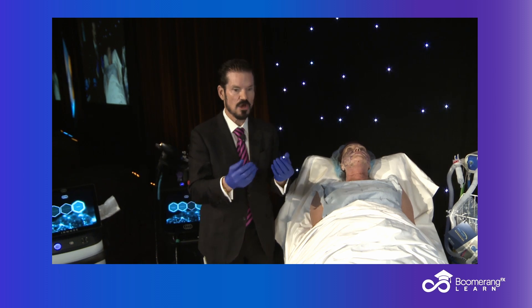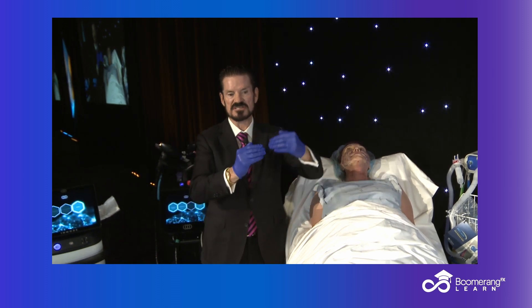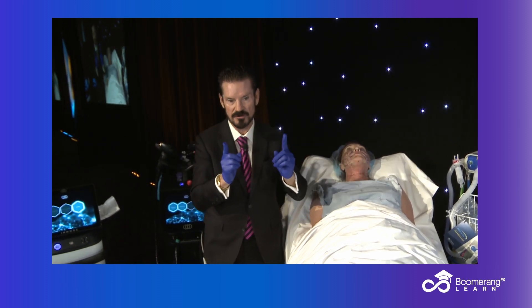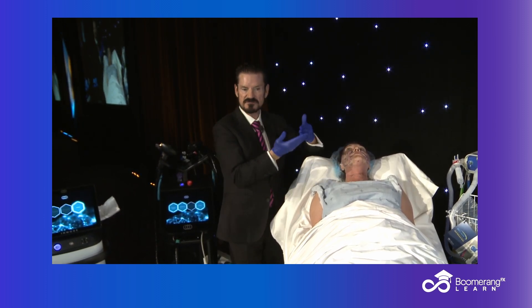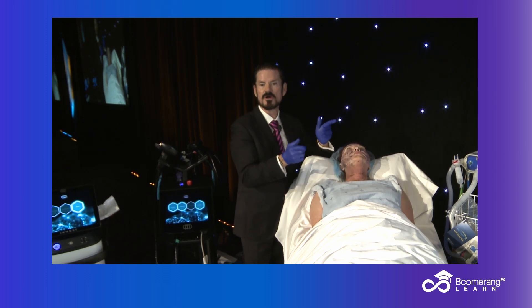The type of coagulation and tightening will be far greater than Morpheus, which takes a longer time to do. However, you have to be brave enough to put in a little bit of local and go under the skin with a relatively simple technique — the quantum RF10.